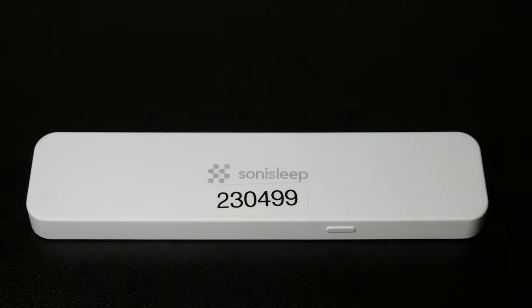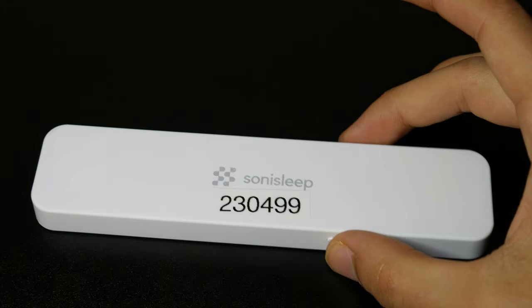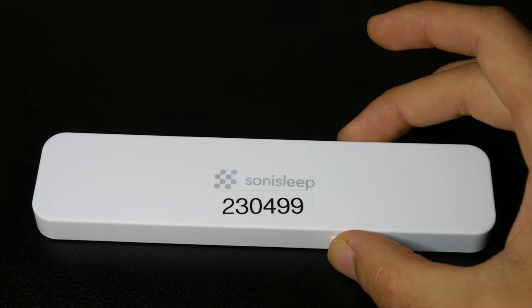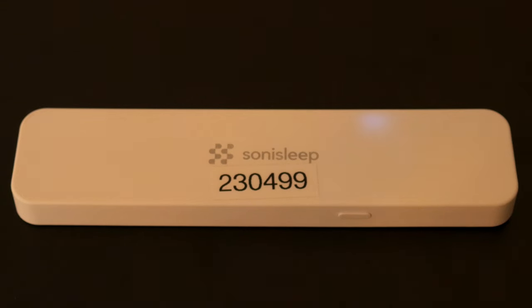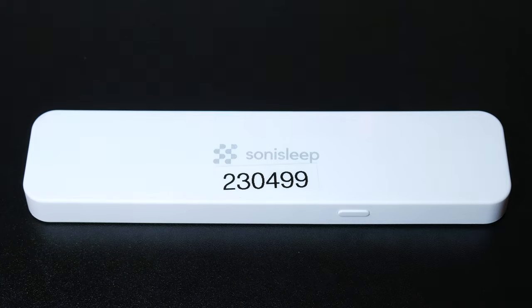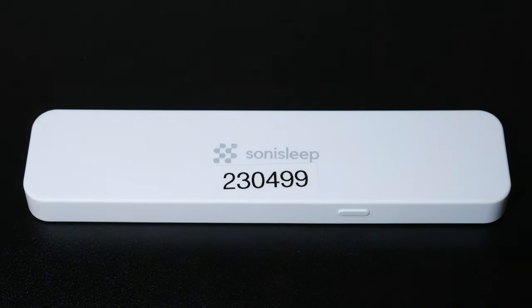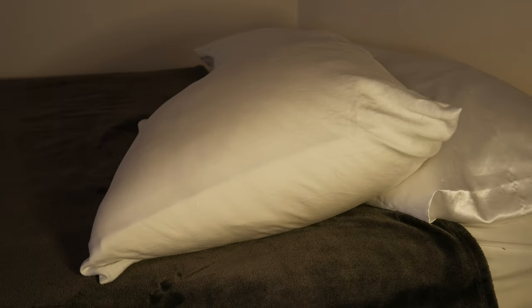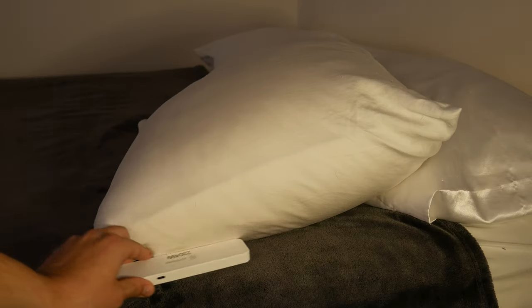To use this device, you must first turn it on by holding down the power button on the side for a few seconds. Once you have held the button, you should see a light start to blink indicating that it is on. From there, you can connect it to your phone via Bluetooth. Now that your device is connected, you may slide it under your pillow to use the device.